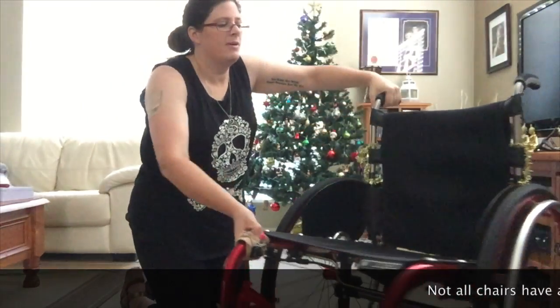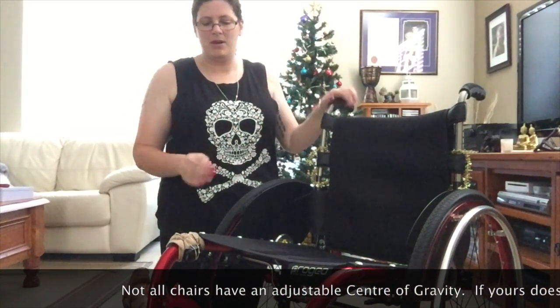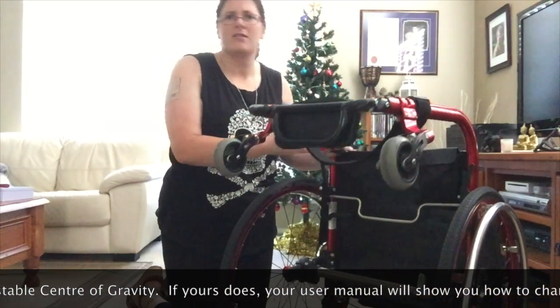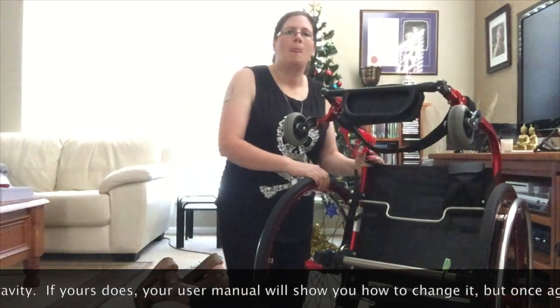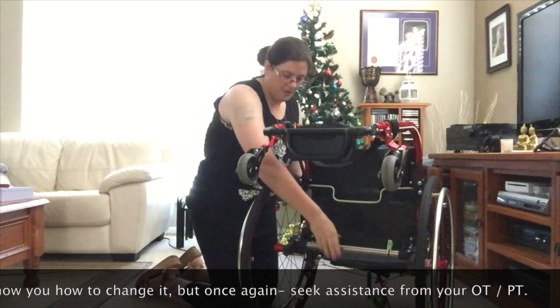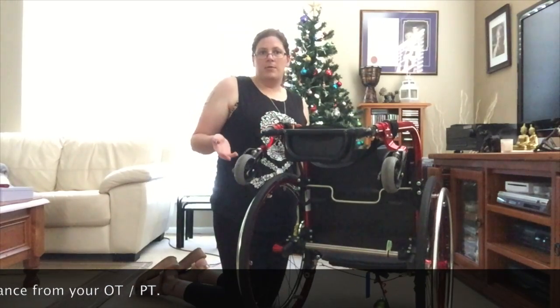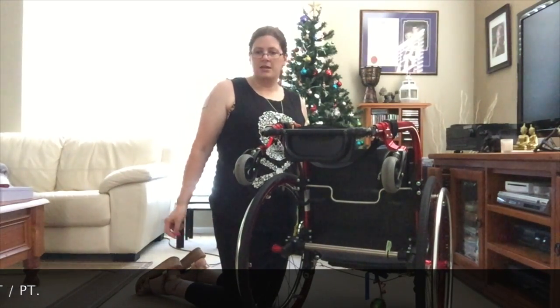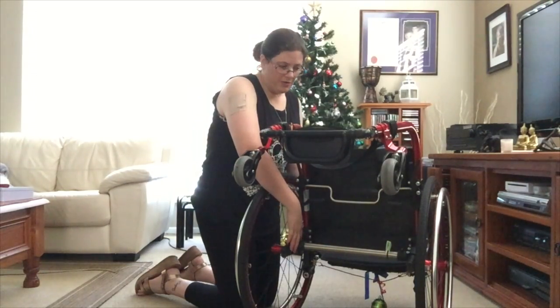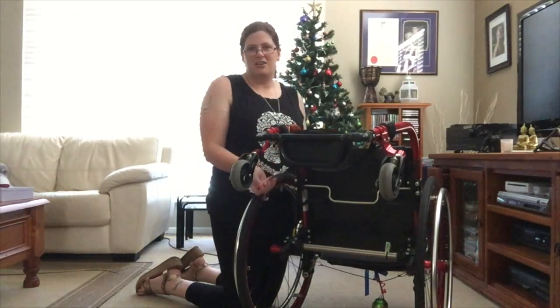I thought I'd quickly show you roughly how you would change it. It's Allen keys and so on. My chair actually drops down occasionally when I drop off of curbs. This rod here slides down on these bars, so that actually changes the height of where my wheels are sitting. So if your fingers weren't reaching the hub, you'd change the height here. Occasionally when I drop down curbs it shifts and I have to change it back.